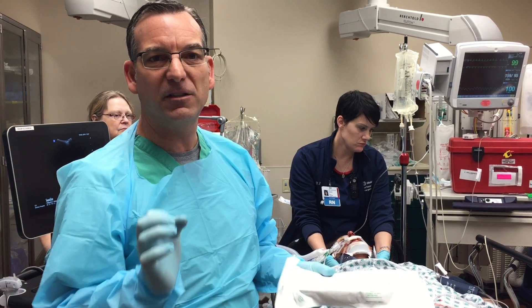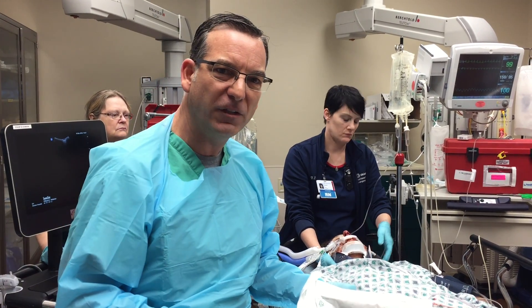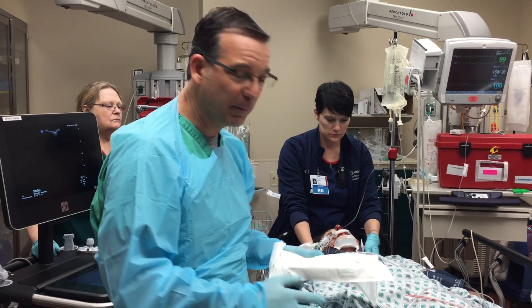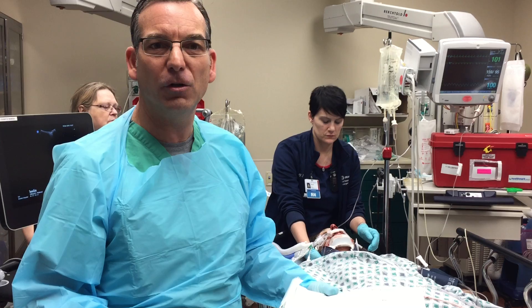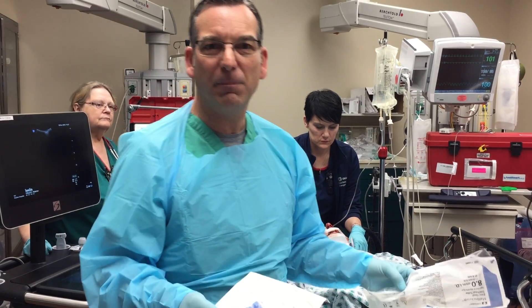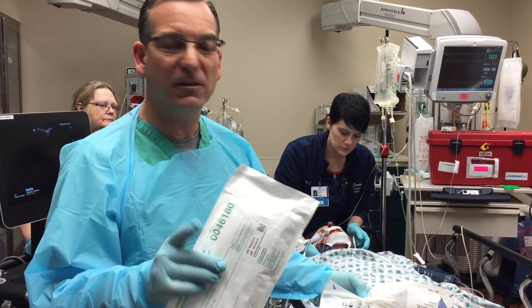A new technique I developed for when it's difficult to get an NG or OG tube in. This is a patient who just came in, found down — the nurses had a difficult time placing an NG tube and an OG tube. So I came up with a way that we can rapidly put an NG tube in in two seconds.